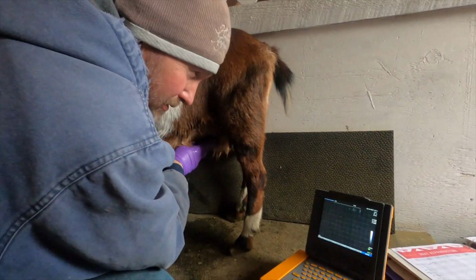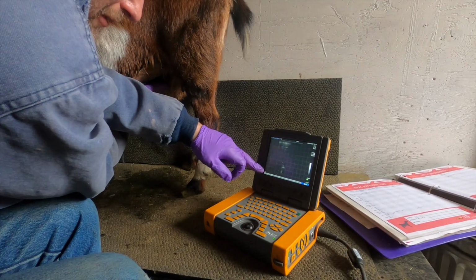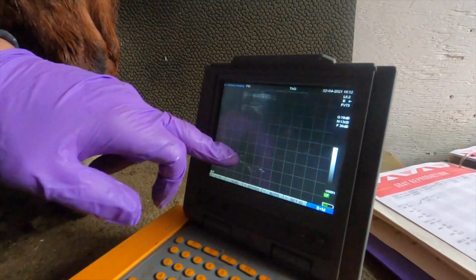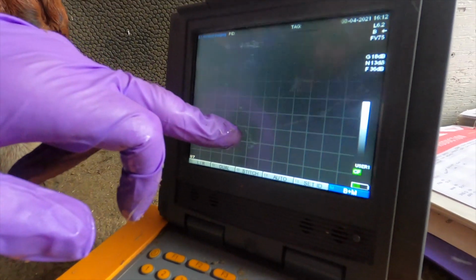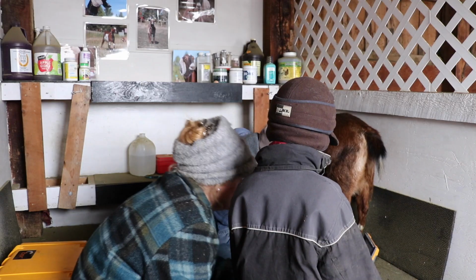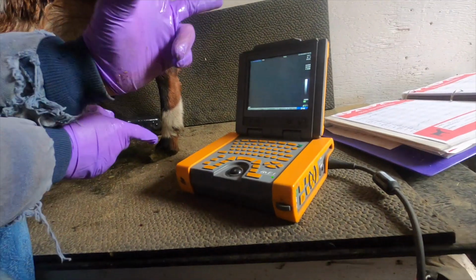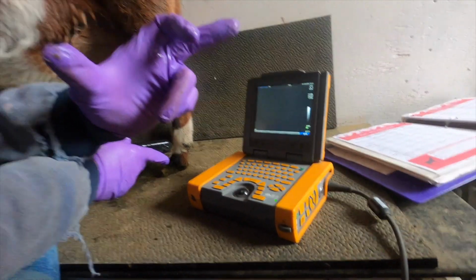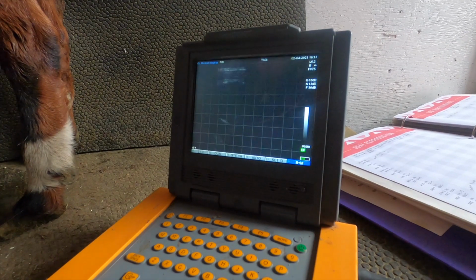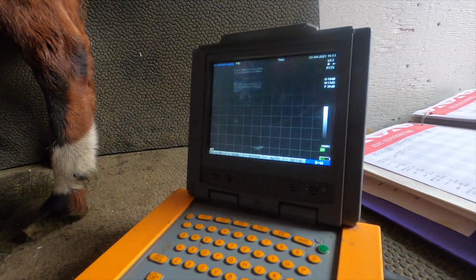Fiona, you better be bred, because I haven't seen her come back into heat. Our baby's right down here. Yeah, I can see it moving. There's a rib cage right there. There's a heartbeat right there. You aren't moving it. They're actually pretty close to the size of, they're probably about that big. See it moving in there? Not quite yet. We've got a little developing to do.